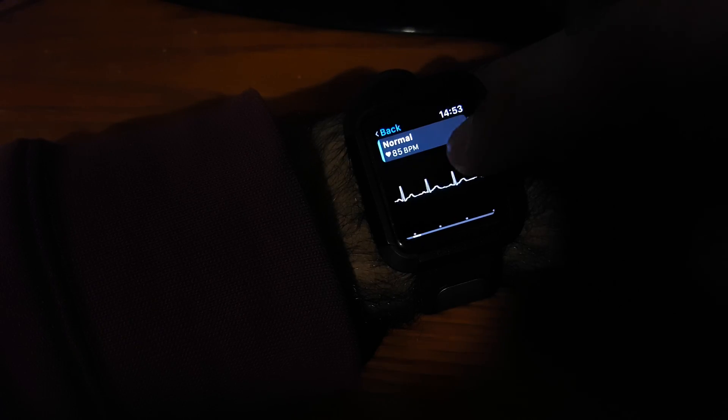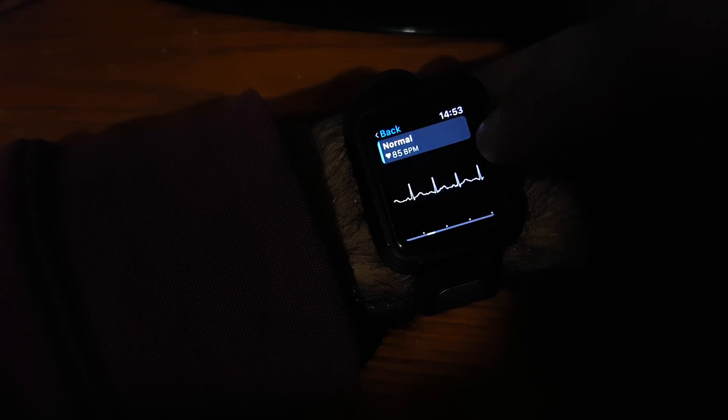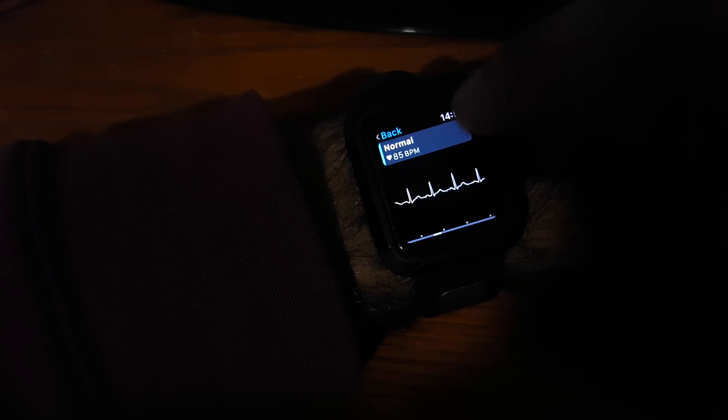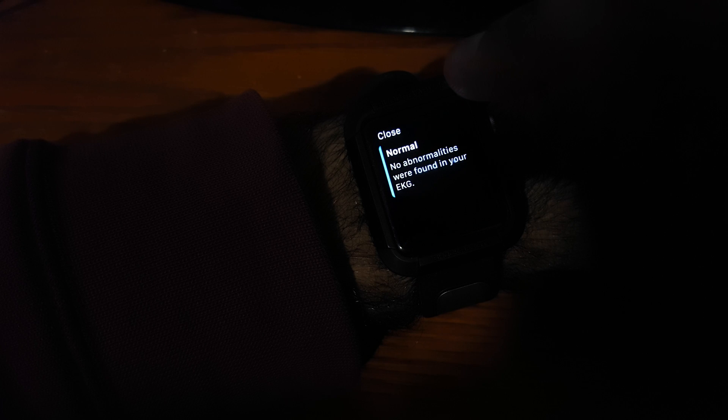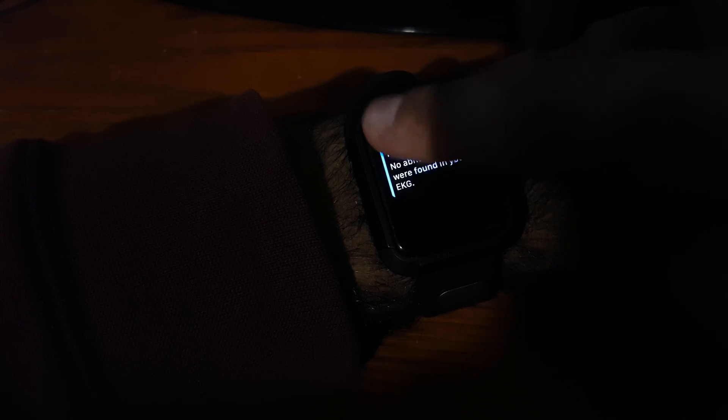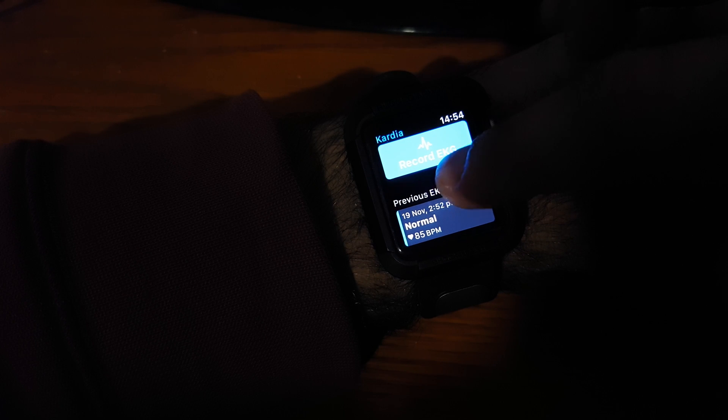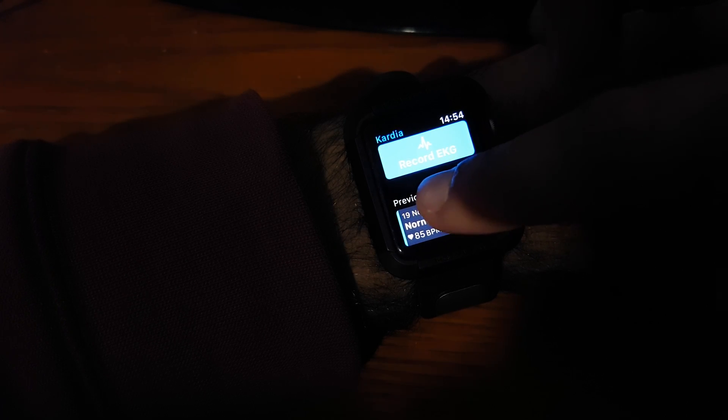Now I can actually look through, see through the reading, just by swiping on the surface of my watch. If I actually go back into here, you can see previous EKGs.